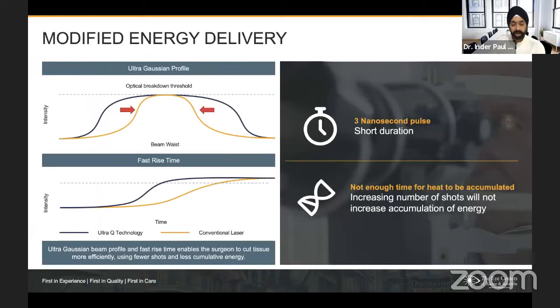All right. Any thoughts so far? I want to move forward a little bit, but any thoughts so far, Dr. Biswas, on what I just mentioned earlier? Well, I must inform you that there's a question by Dr. Regis Tan about the number of shots that one can deliver for this laser. His question is, is it 250 or more? What is safe?